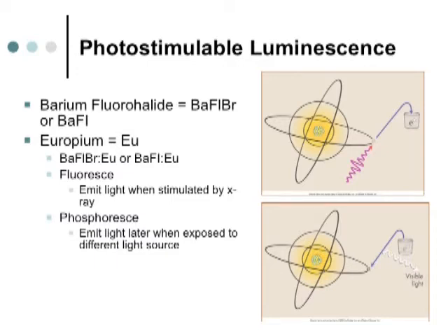How do we do that? By using a laser light. We can expose them or stimulate them with a laser light, which will put them back down into their orbit, and when they come back down into their orbit, they'll give off light again. Okay? That light that's contained, or the position of these electrons on the plate, is called the latent image. Just like we had a latent image on a film.